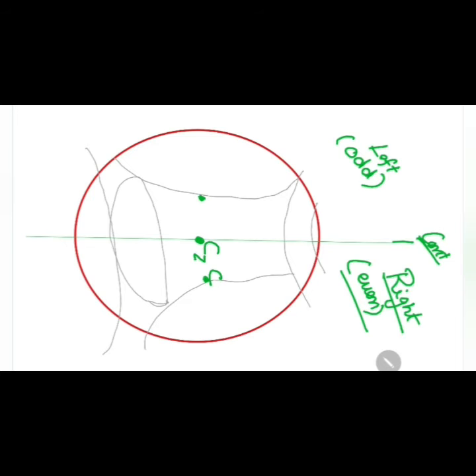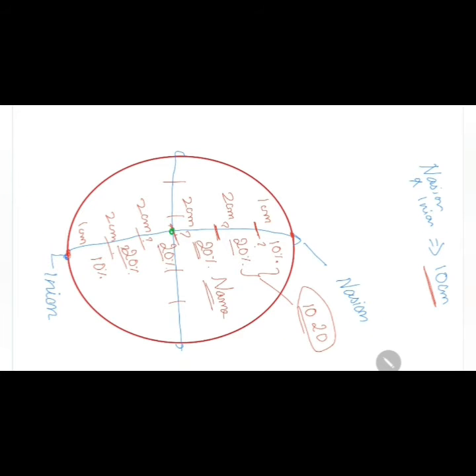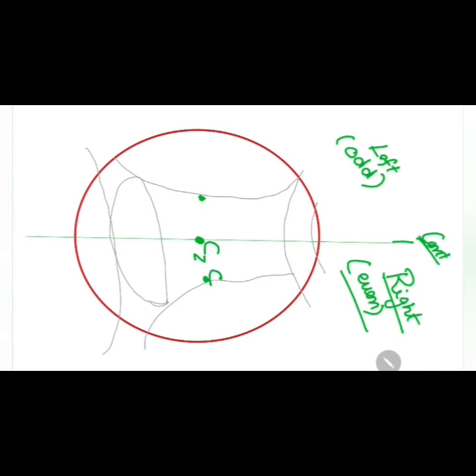The reason is, come back here, if you see from here to here the distance is 20%, right? So if it is 20%, which means we are skipping one electrode that is to be placed here. So the C2 should have been here, but we have skipped it. So we should not write C2 here, it should be C4, because C2 has been skipped, because the distance here is 20%. Similarly, on the left side it should be C3, C1 is skipped, right? So now we have placed the center electrodes.